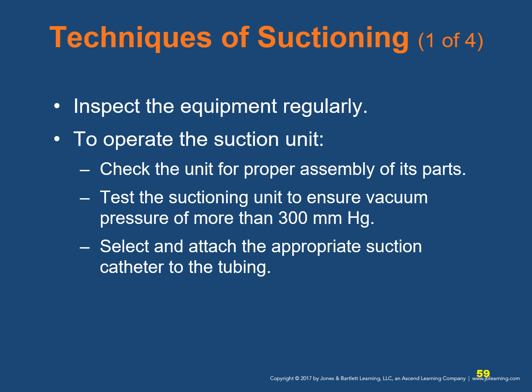A suction catheter is a hollow cylindrical device used to remove fluids from the airway. A tonsil tip catheter is the best kind of catheter for infants and children. The large diameter plastic tips are rigid and do not collapse. Tips with a curved contour should allow for easy, rapid placement in the oropharynx.